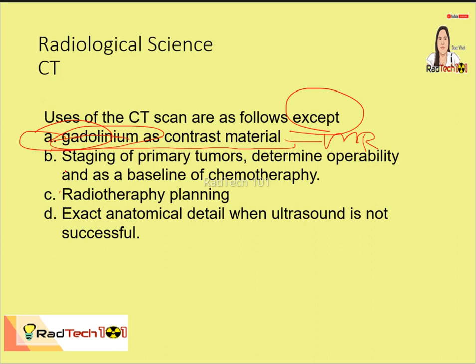CT scan can be used for staging of primary tumors. Also determine the operability and as a baseline of chemo. Also used for radiotherapy planning. So, instead of using simulators, CT na ginagamit sa mga modern facilities. Also, exact anatomical detail ay makikita sa CT scan when ultrasound is not successful.